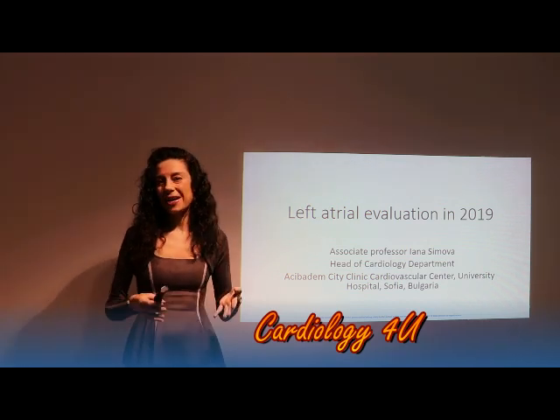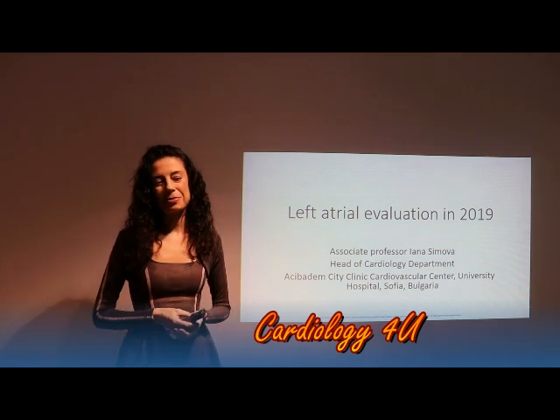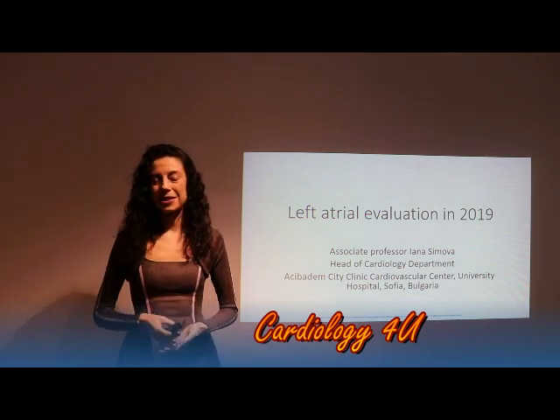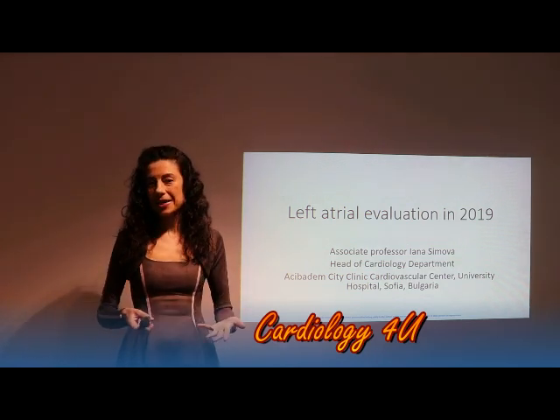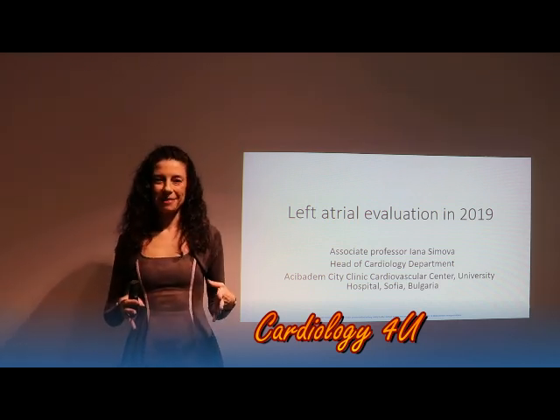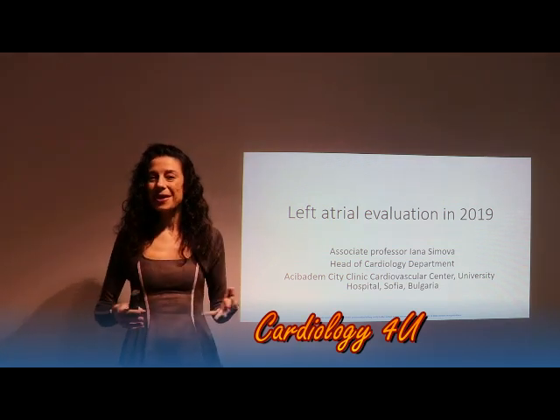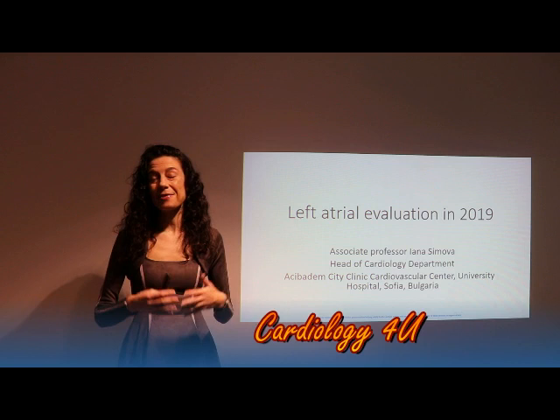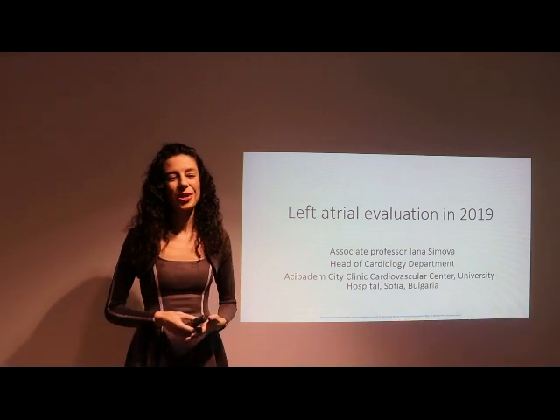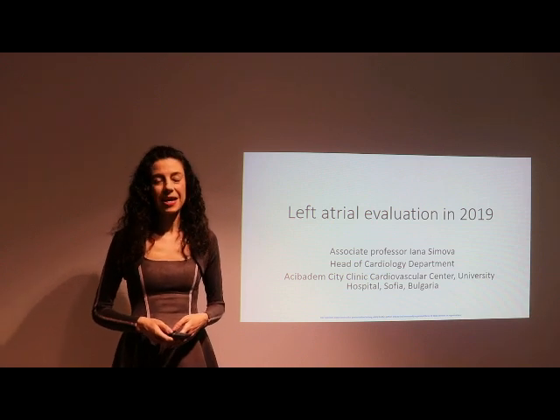This time I have chosen to talk about a topic because maybe it would be some of the last videos in this year, 2019, and I would like to talk a little bit about the left atrium and what was new and what was old in the evaluation of this chamber in the year 2019.